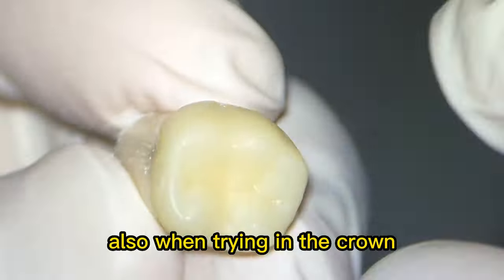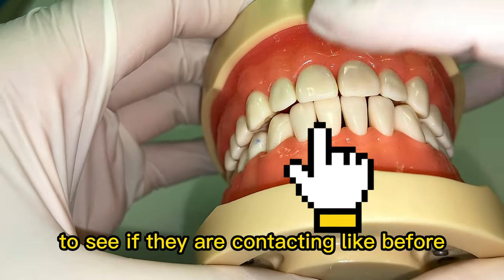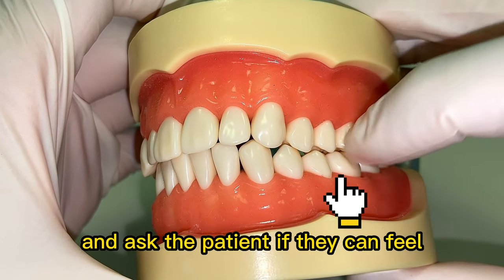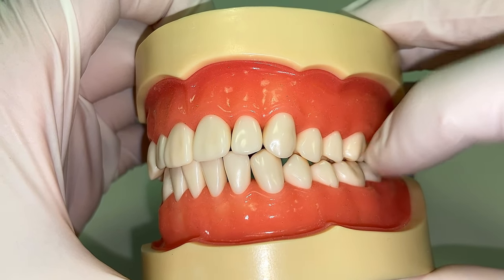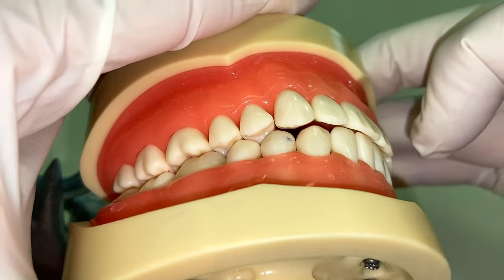Tip number seven: also when trying in the crown, look at the incisors to see if they are contacting like before, and ask the patient if they can feel their teeth contacting on the non-anesthetized side. This can speed up occlusal adjustment of your temp crown.